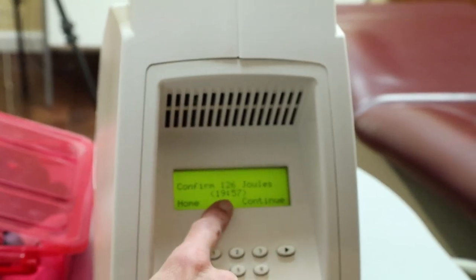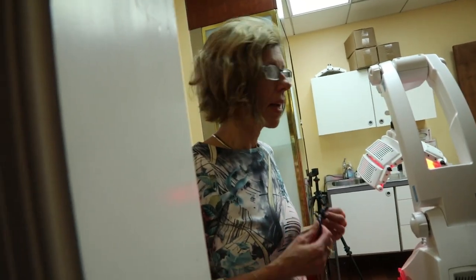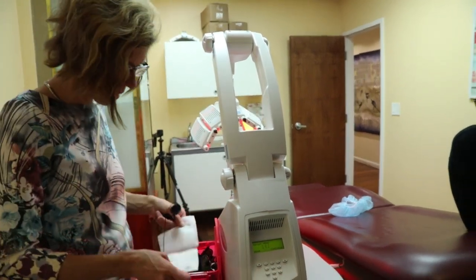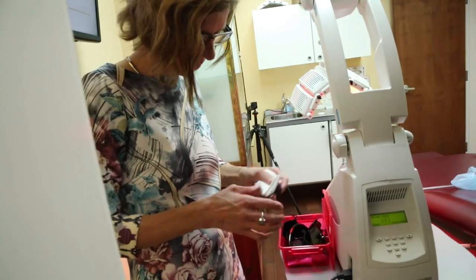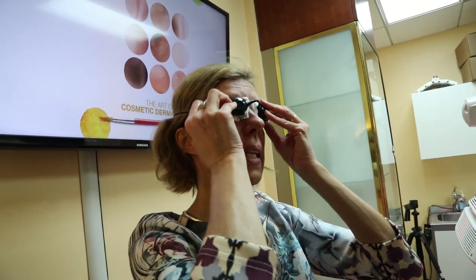You're going to be asked to confirm, and you say yes, continue. This is the moment that you are adjusting so that it fits over the patient. Many times the patient will say this is awful, it's so bright. You have to prepare the patient beforehand — it's going to be very, very bright. Sometimes we use extra gauze underneath, and you want to be sure that you're not obscuring too much skin so that you still have even activation, particularly for people who have actinic keratosis.